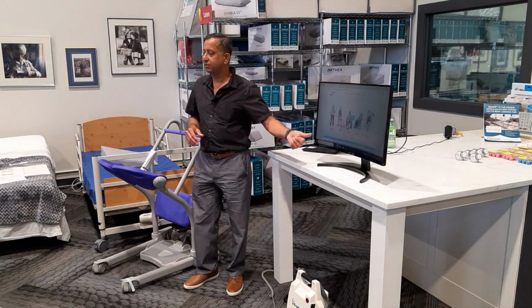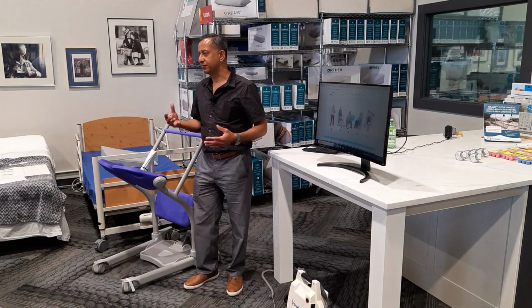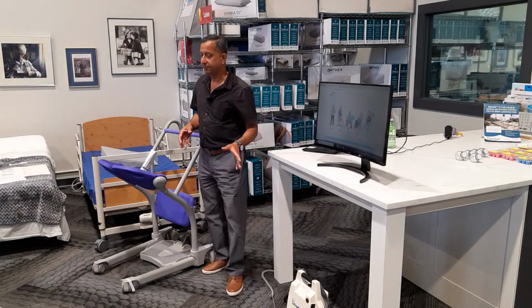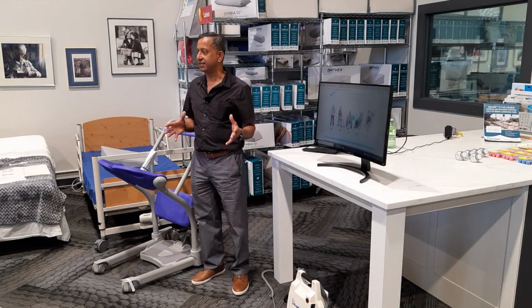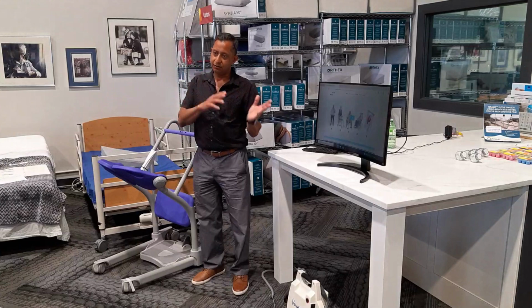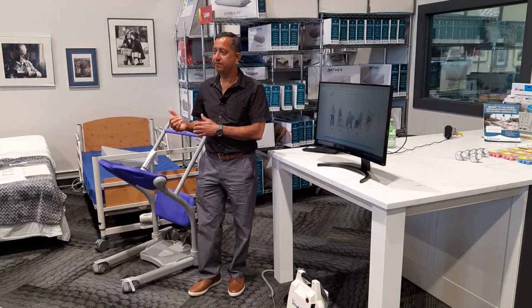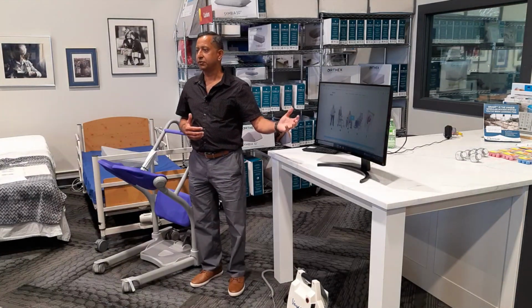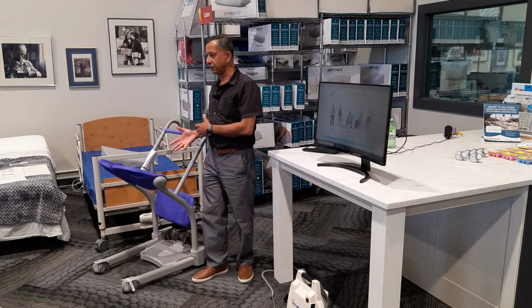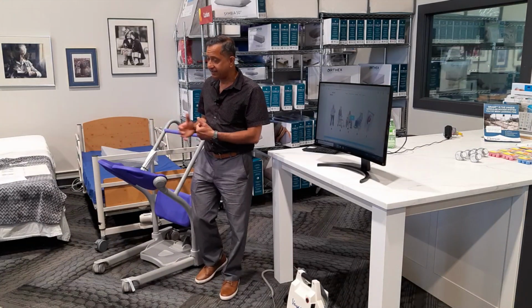In the case of Albert, you generally do not need any kind of device except a cane, or in case of emergency, maybe a walker. In the case of Barb, who uses a walker, Barb is good during the daytime. Let's say Barb gets up in the morning, gets out of her bed, goes to the bathroom and the dining area with her walker, has her breakfast, and goes back to her room. Come evening, she goes out for dinner to the dining area. Now she's very tired and cannot go back to her room. She asks someone to come and help her go back to bed.